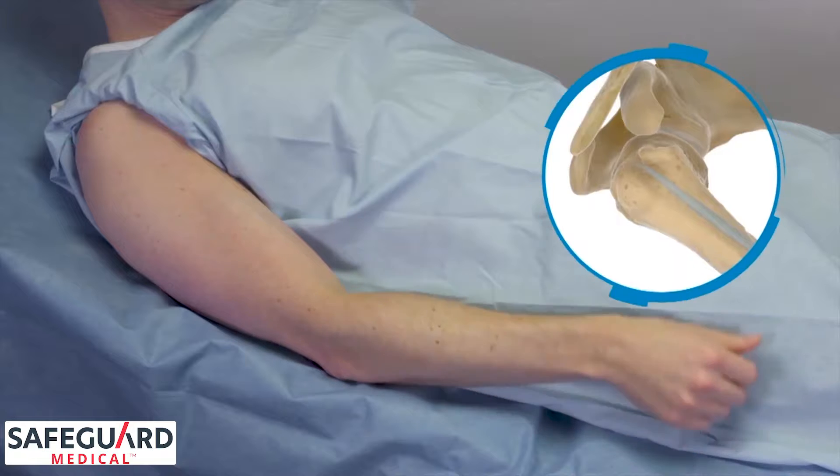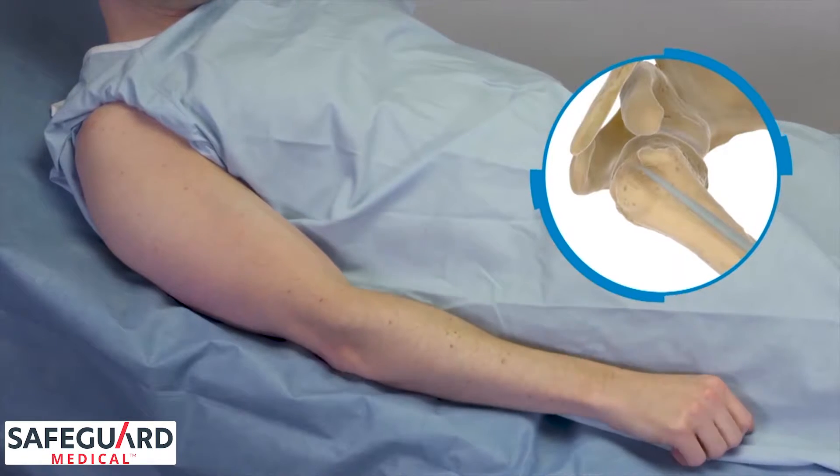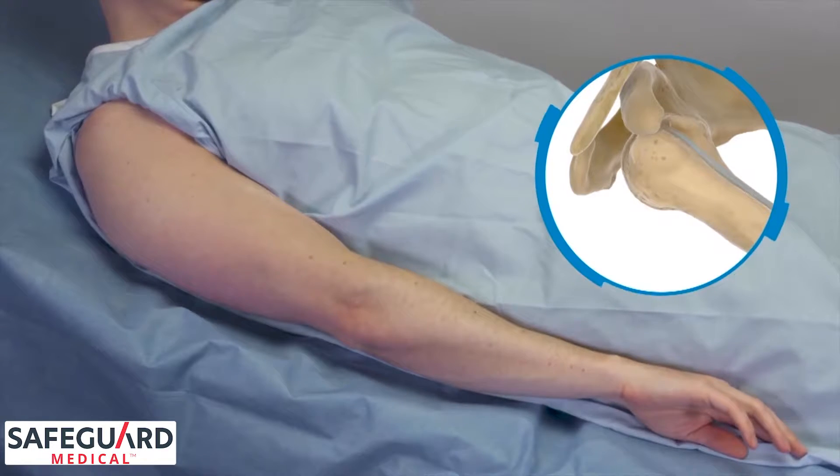First, position the patient properly by internally rotating the arm. This will protect the bicipital groove and better expose the greater tubercle of the humerus.